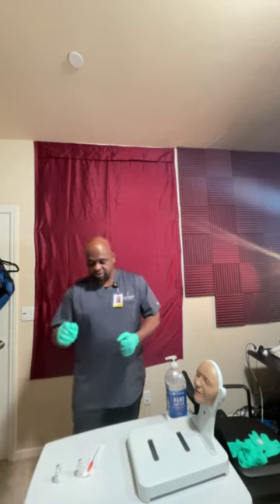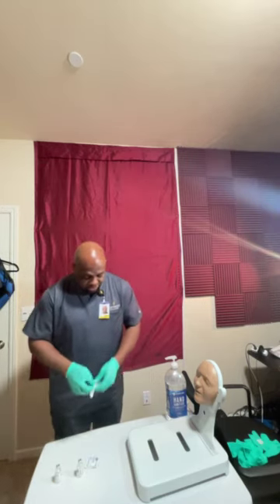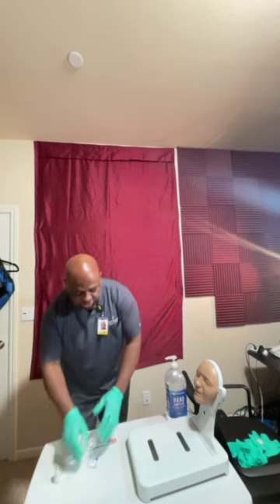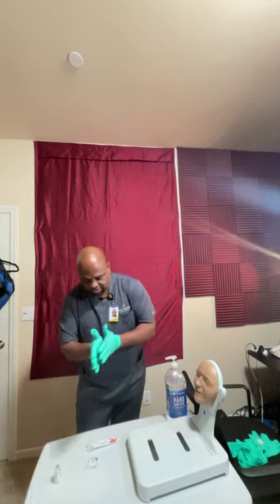And just FYI, from this point on, I will make sure that when I'm drawing up the insulin, even drawing up the air to put into the syringe, I'll have a fellow nurse there to verify, right? So what I'm going to do is take the tops off of the insulin, and make sure they're not expired. I'm going to slightly rub them between my hands, right? Kind of warm them up, get them ready, and prep them, right?